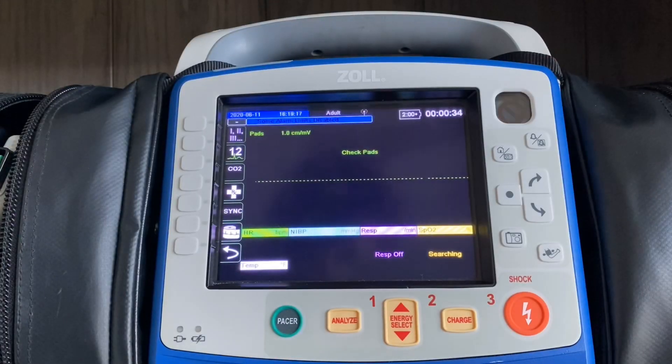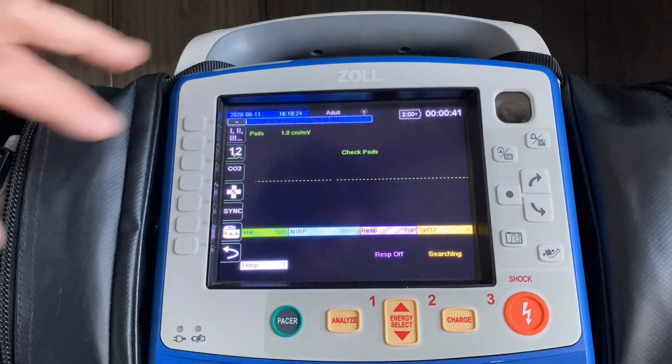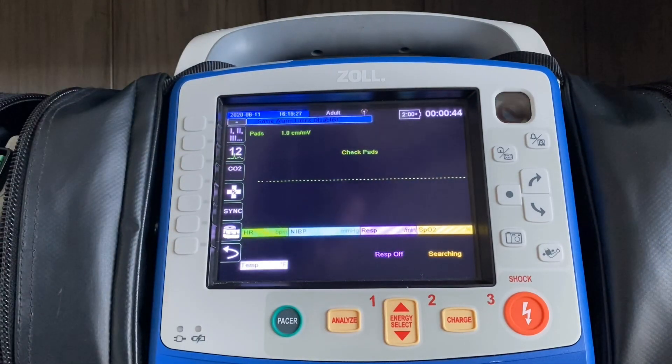The way the X-Series software works is every time you turn it on, it assumes you're about to run a call on a cardiac arrest patient. What I mean by that is it's always going to be in pads mode in the upper left corner, expecting you to apply defib pads to the patient's chest and perform CPR. On a normal call or a chest pain call, as soon as you place the limb lead cables on the patient, that'll switch from pads to lead two automatically.